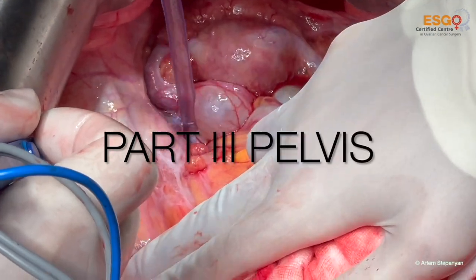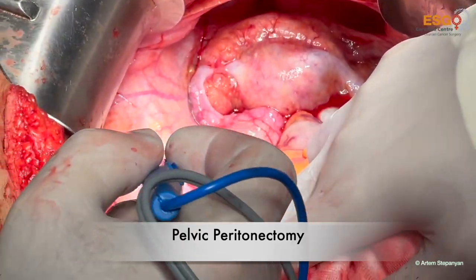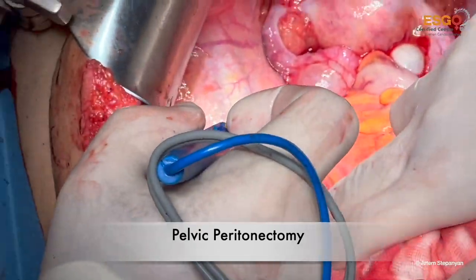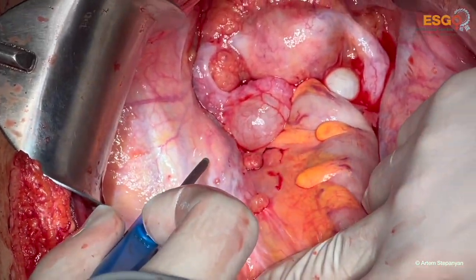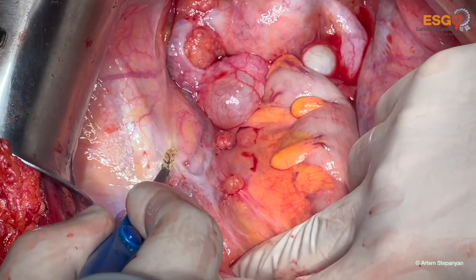Looks like the middle abdomen is okay. Now the camera is moved towards the head of the patient, and we can see the situation in the pelvis.